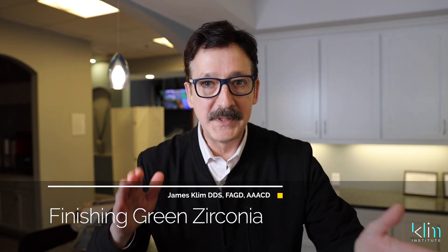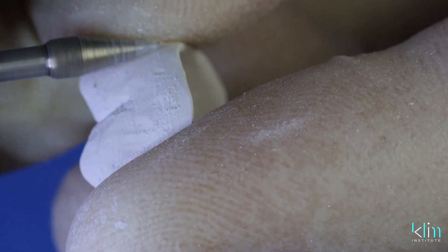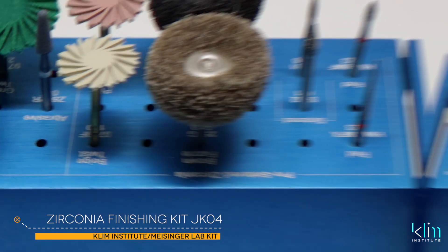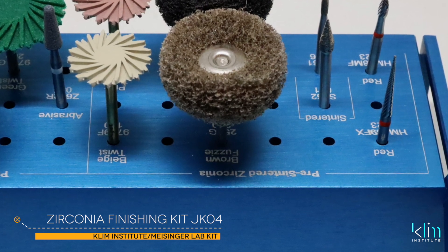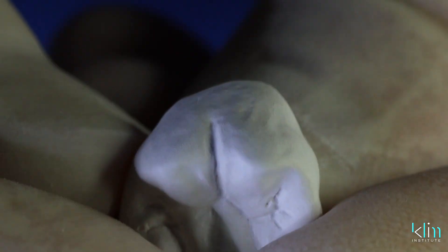Finishing green zirconia with the products we have today — whether we infiltrate, stain and glaze, use a multi-layered zirconia block, or all three combinations — I like to do my shaping, texturing, and luster finishing before we sinter. That's what this video is about. We're going to go through the JK04 Meisinger finishing kit, using the pre-sintering side of the kit to finish the green zirconia.